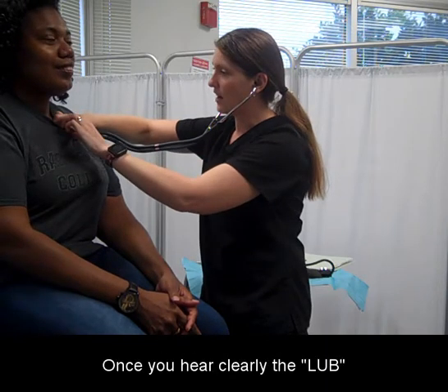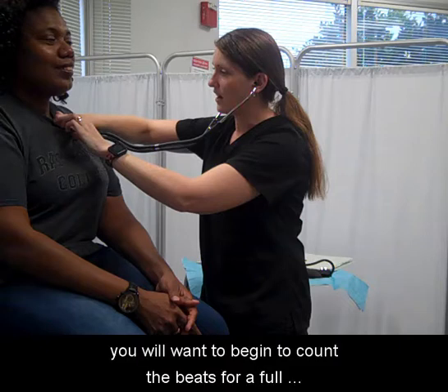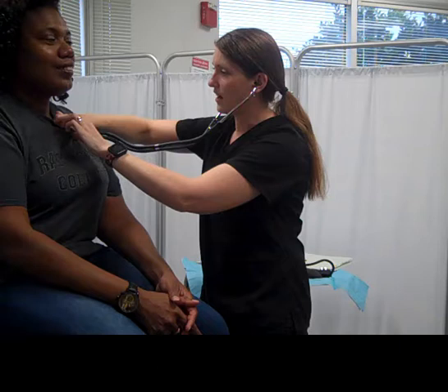Once you hear clearly the lub-dub sound of the heart beating, you will want to begin to count the beats for a full minute. One lub-dub sound counts as one beat per minute.